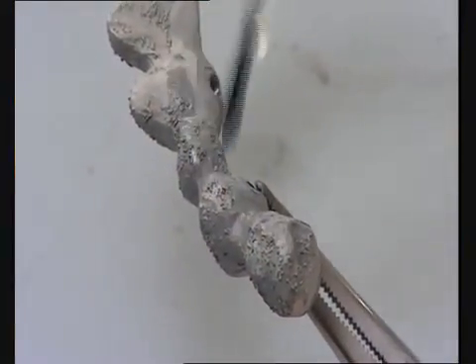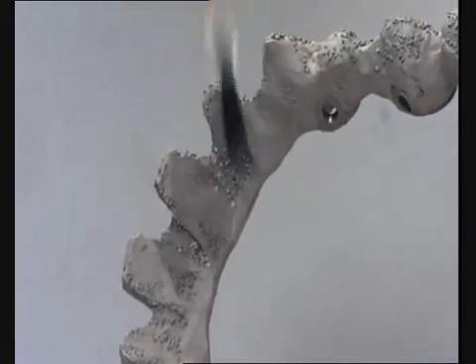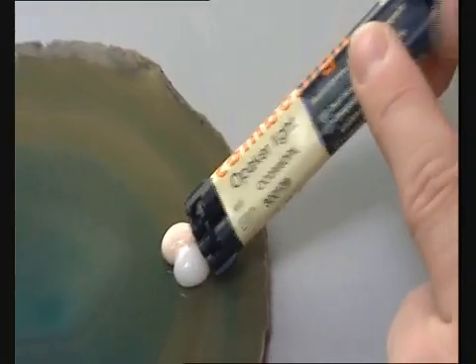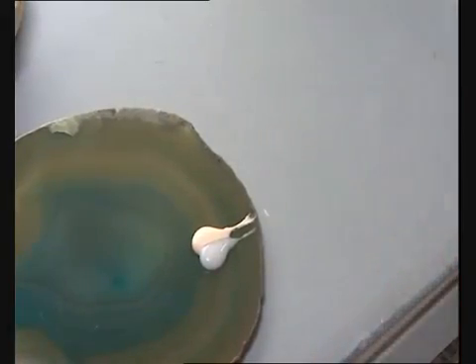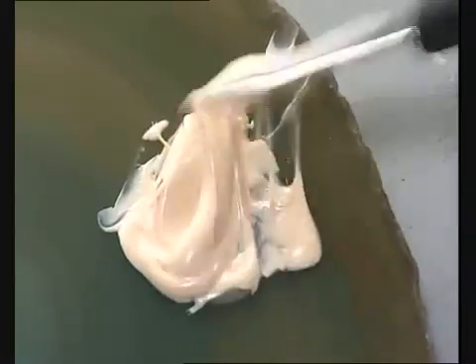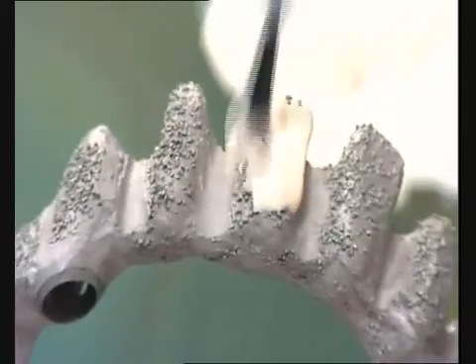Metal primer is now applied. To ensure that the facing is durable and has a stable shade, it is essential to use a high-quality opaque. Combo line opaque is dual curing, which guarantees full polymerization. The framework should be coated with opaque before bonding the veneers.